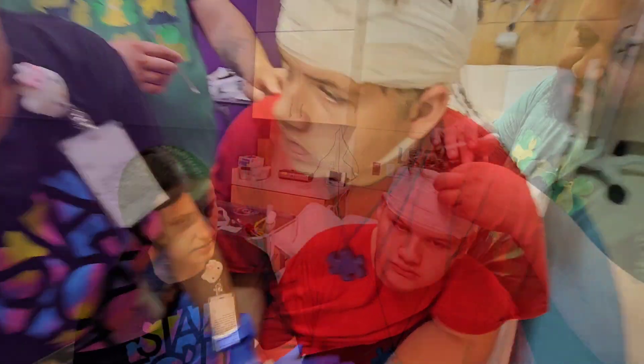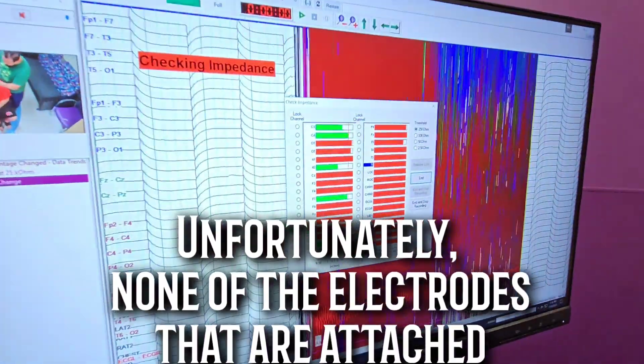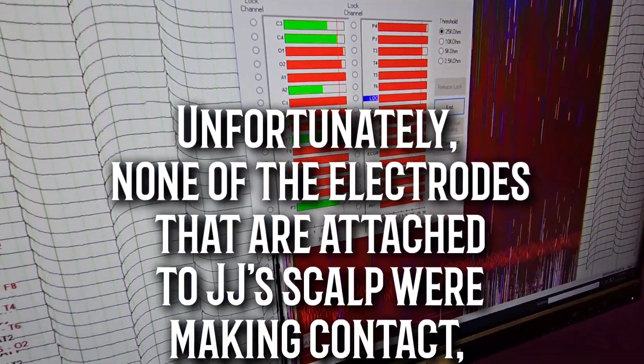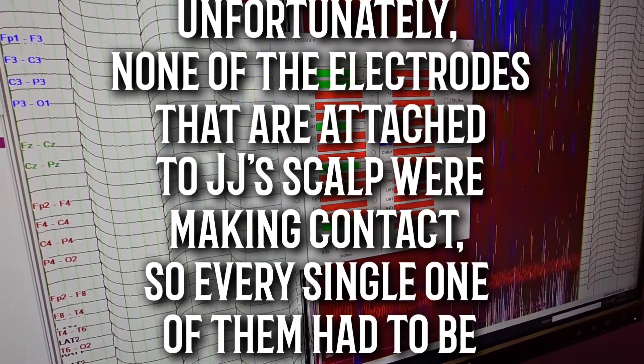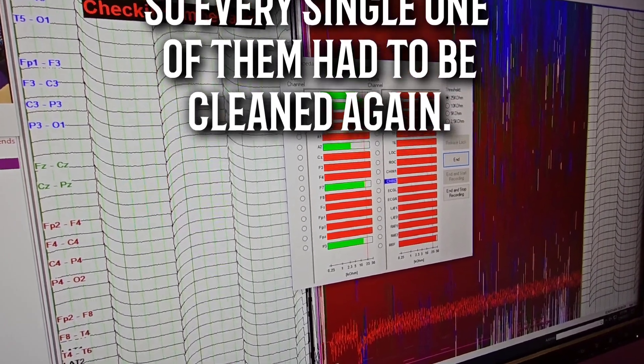It's okay, good job — yay! See the ones in red JJ? Look at the ones here in red — see these here? We want to see them turn green. They're gonna turn green when he cleans them for you, they start turning green.